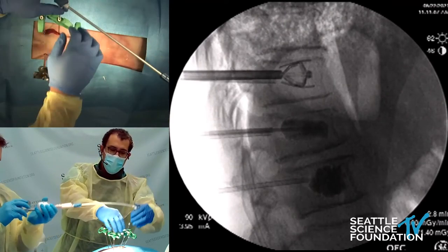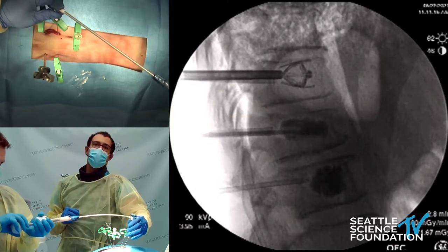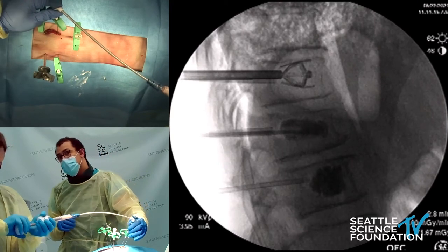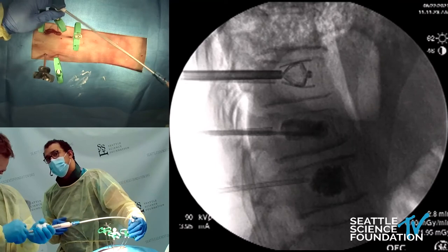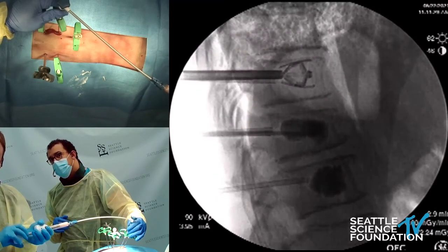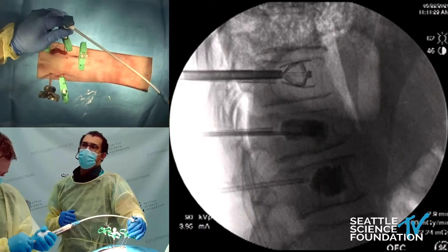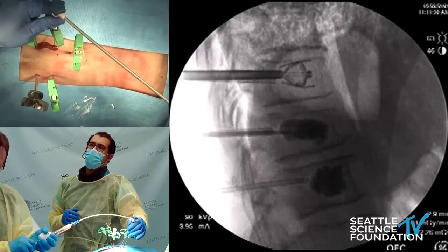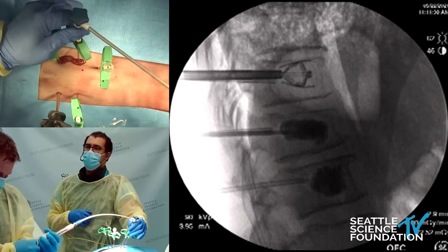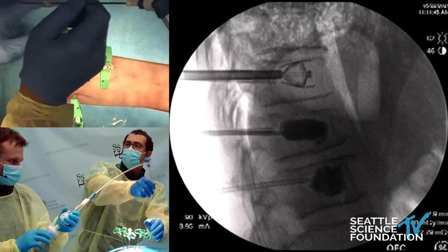We'll come to our opposite side here. It's hard to tell exactly where you are — you might want to use an AP — but we'll go ahead and fill it. We're getting that contralateral flow, you can see how that cloud is getting darker with the double density. We can see those bridges coming across, which gives us a lot stronger support of the vertebral body.